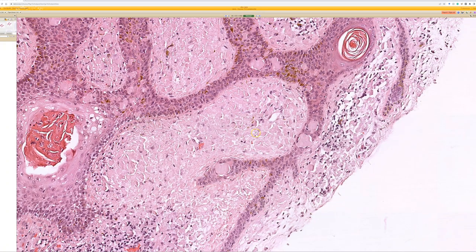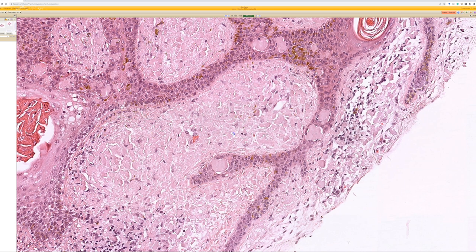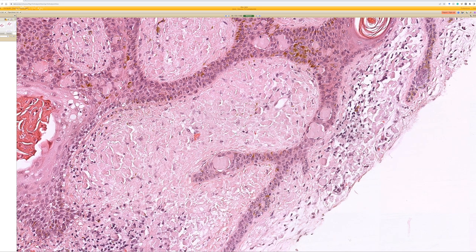A great example of that keratin-derived amyloid process in action. Here it's a lot more abundant than we saw in the macular amyloid, and it's just incidentally seen in this seborrheic keratosis. You often do see this in association with seborrheic keratosis, but you can also see it with a variety of other epithelial neoplasms, including basal cell carcinoma, sometimes benign hair follicle tumors, and others.